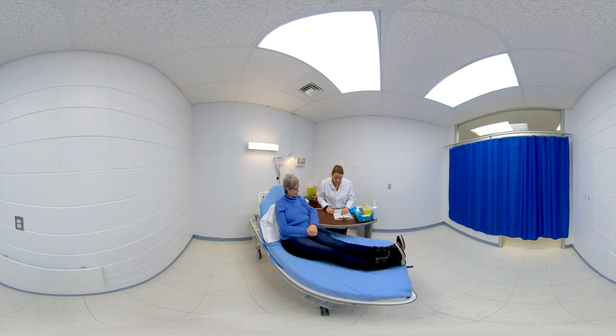Mrs. Blacksmith consulted her attending physician after experiencing an episode of fatigue, and the latter concluded it was necessary to do blood tests. You have just begun your shift at the blood sample laboratory and Mrs. Blacksmith comes to see you for a venipuncture. The laboratory technician verifies the types of samples to be taken and their particularities in the patient's file, ensures that the request and identification labels are completed, and performs a double check with the patient to avoid errors and find out if the patient has allergies.